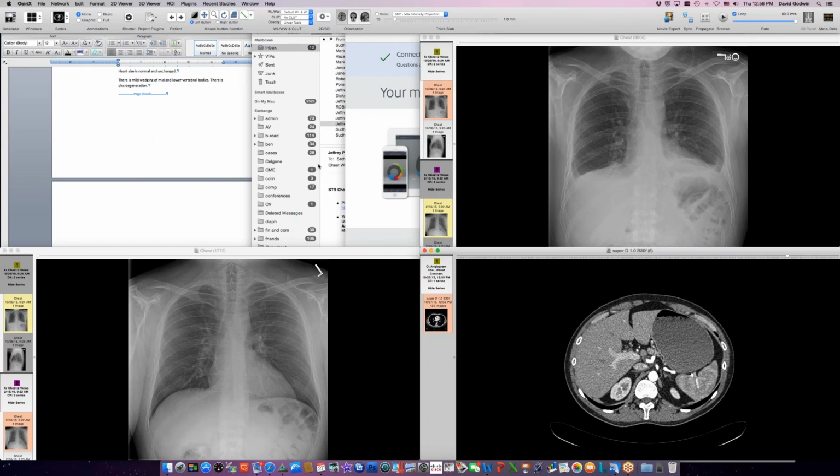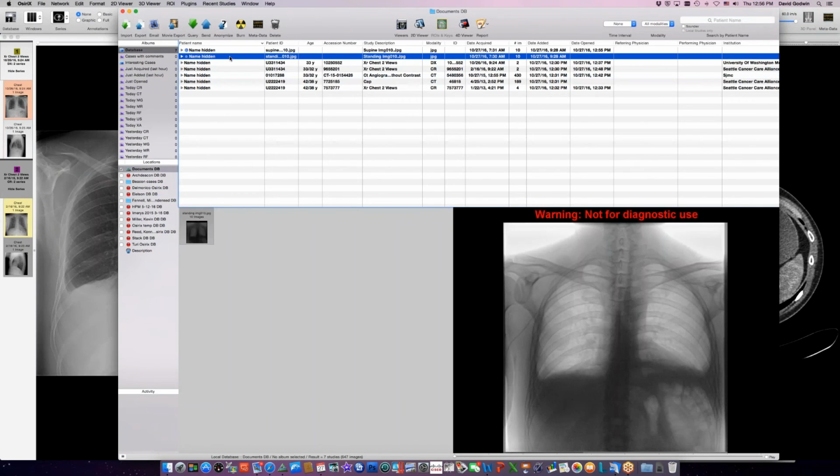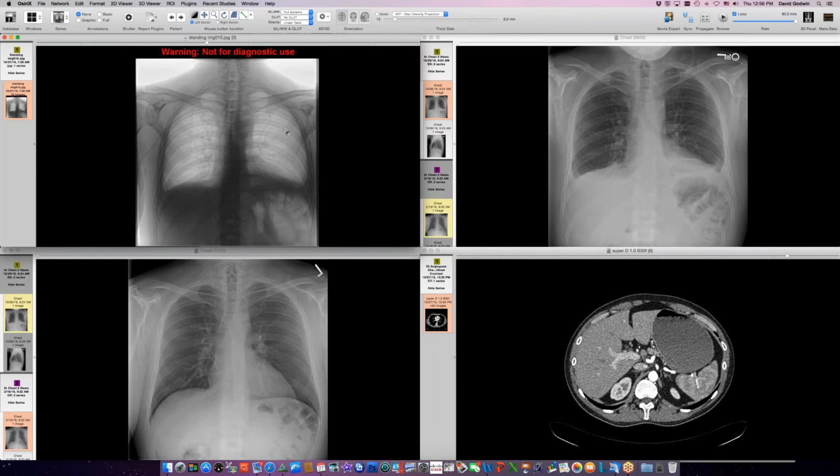Let me do this standing here. So this is standing, and you see he's got somewhat more respiratory excursion here. And it's orthograde, so when he breathes in, his chest wall goes up and his diaphragm goes down. I'm sorry the motion is jerky here, but you see he's got reduced diaphragm excursion, but it is orthograde, so he's got some muscle function. He's not paralyzed. If he were completely paralyzed, the diaphragm would be dragged up by his chest wall going up, and we'd see basically paradoxical motion on both sides.